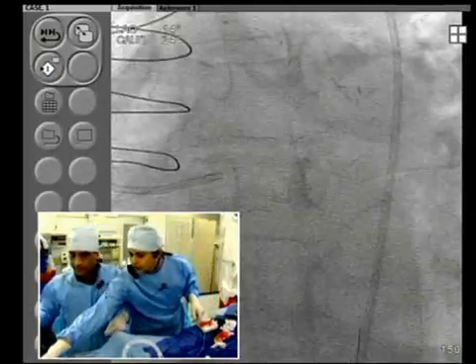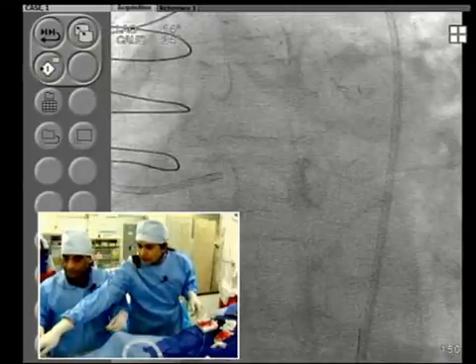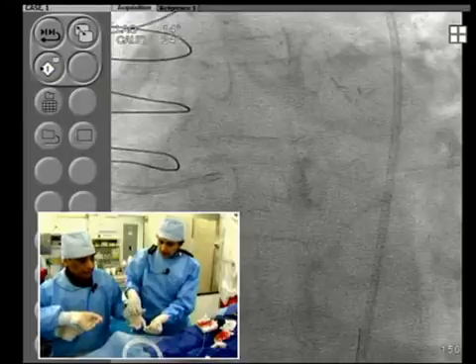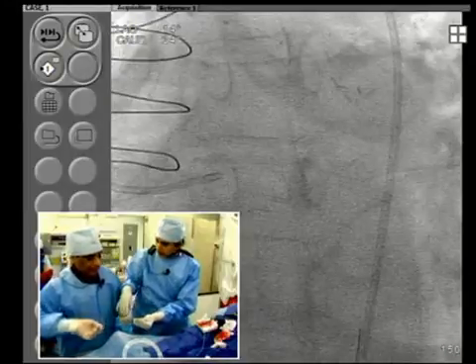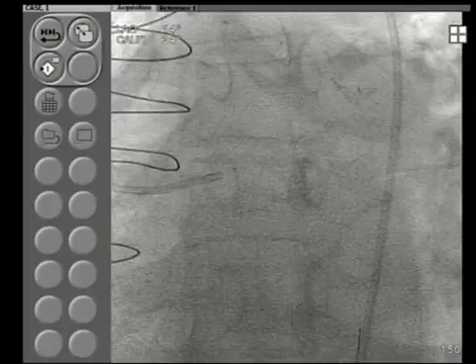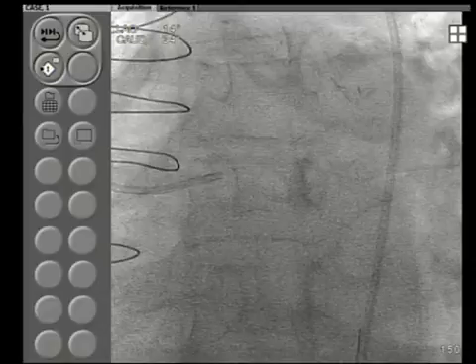Fine cross. And Samin, in this particular case, did you have to rotate only in one direction? No, we'll not be able to. Stent first. Then things may not go further down. The question comes, let's get the CTO first. No, but this one will be tough otherwise. You want to do it first?